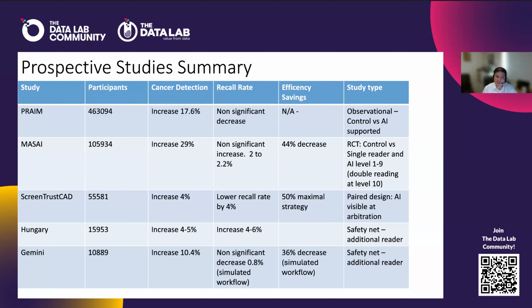Screen Trust CAD was from Stockholm. There was a Hungarian study as well. And our little study in Scotland and Aberdeen was Gemini, where we had about 11,000 women. And we used that as a safety net study.